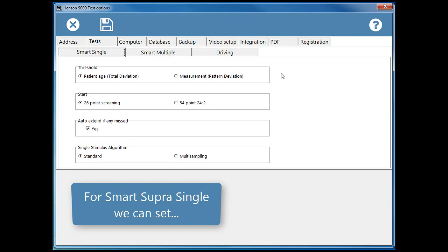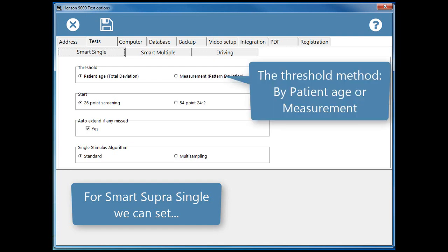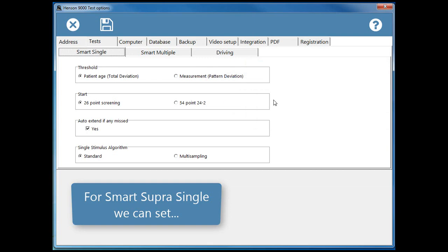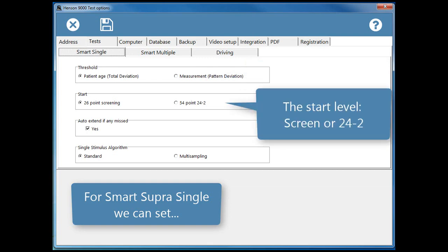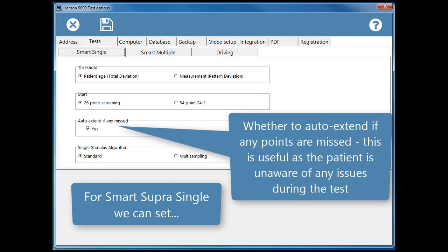For Smart Supra Single we can set the Threshold method, by patient age or measurement, the Start level, screen or 24-2, whether to auto-extend if any points are missed. This is useful as the patient is unaware of any issues during the test.